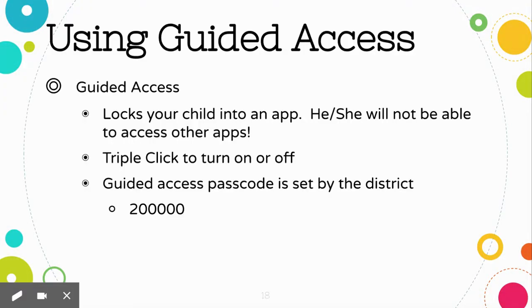So now we're going to talk about guided access. We use guided access to lock your child into the communication app. Many children have had exposure to an iPad as a leisure tool to access YouTube or other games, but we want this iPad to be solely for communication. If they use this iPad to play games or watch videos, they don't have access to their voice to talk about those experiences. We ask that you also use guided access at home and not allow your child to use this iPad for leisure activities.